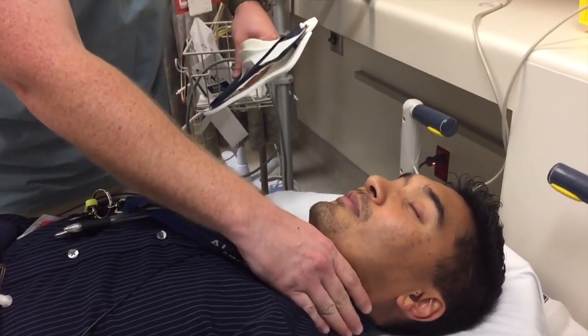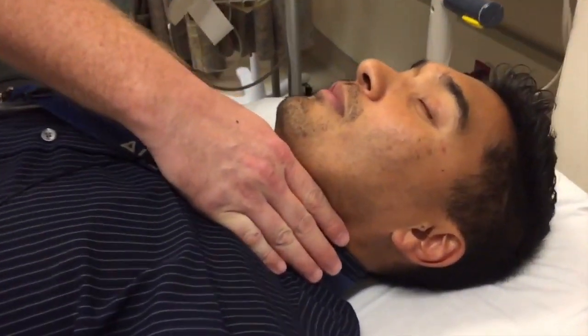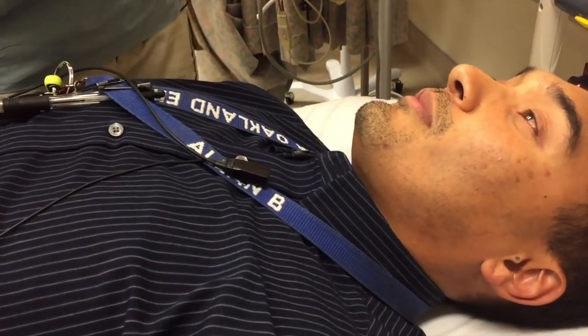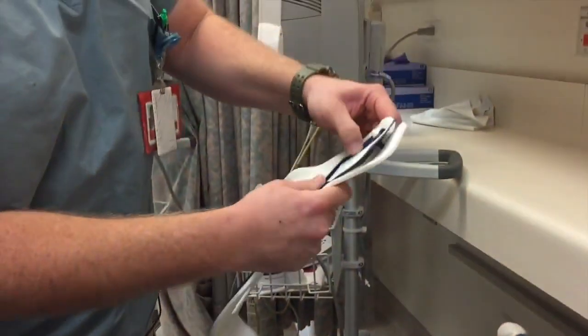So first thing we do is get the C-collar, have him in proper C-spine, have the right amount of staff around. Go ahead and measure — you can measure from the collarbone to his jawline and then adjust accordingly. There are two tabs here on the adjustables; lock those in place.